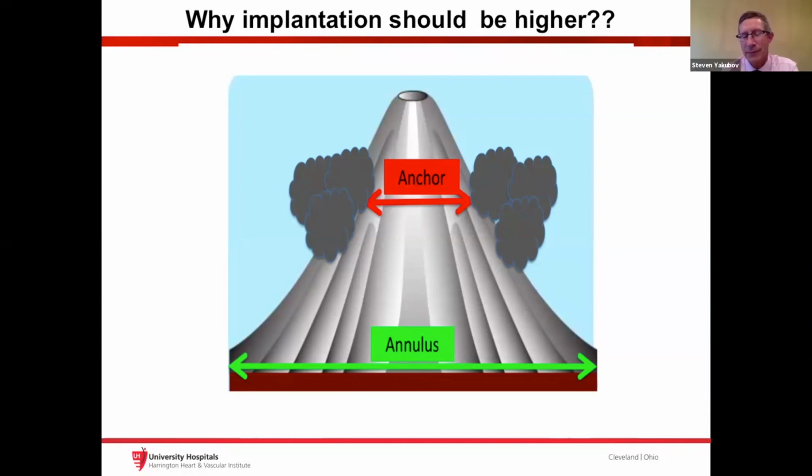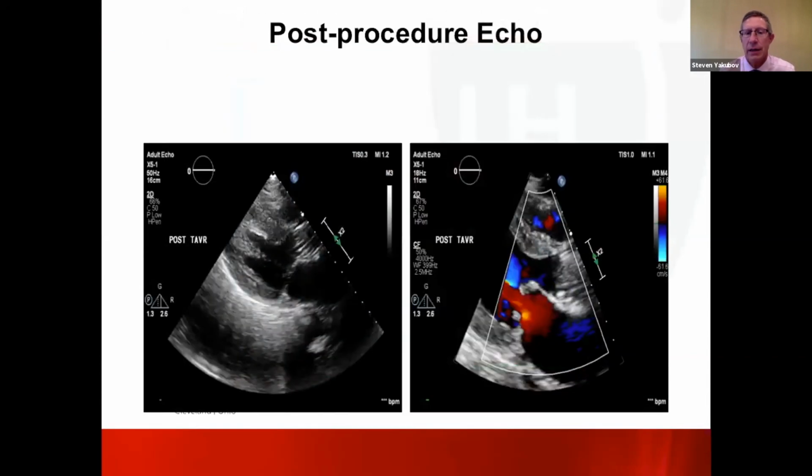So I'm fascinated by Guy's implantation depth because on these bicuspids, especially, the valve looks a little constrained, and I tend to post-dilate them not that uncommonly, just to make sure that the valve frame looks like potentially what the valve should look like in an unencumbered environment. I do want the valve to be able to function adequately. And when you do post-dilate, there's a chance of the valve moving, especially north. So what do you do in those instances, Guy?